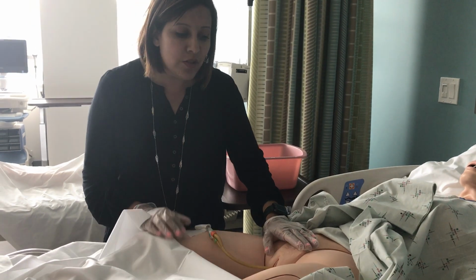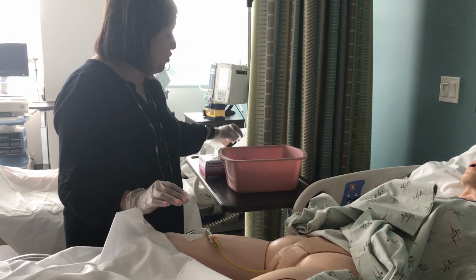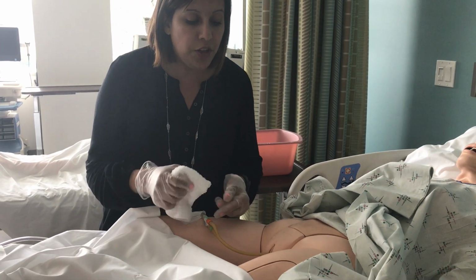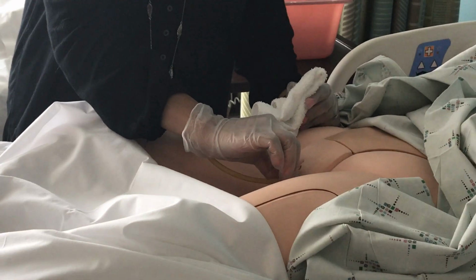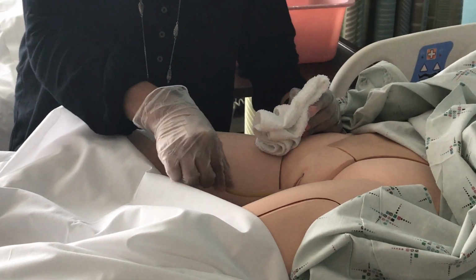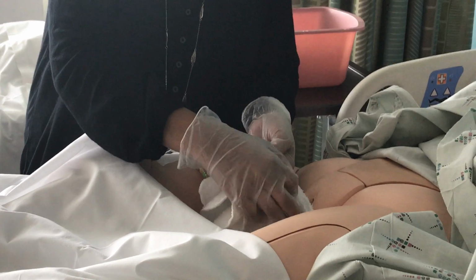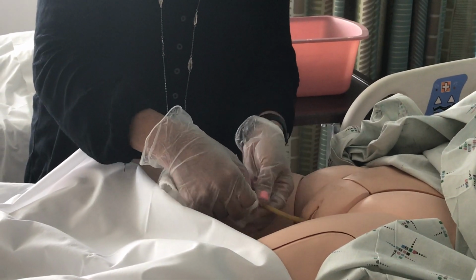After you've done pericare, get a washcloth and clean from the meatus at least 4 inches down the catheter. Again, this is about cleanliness.